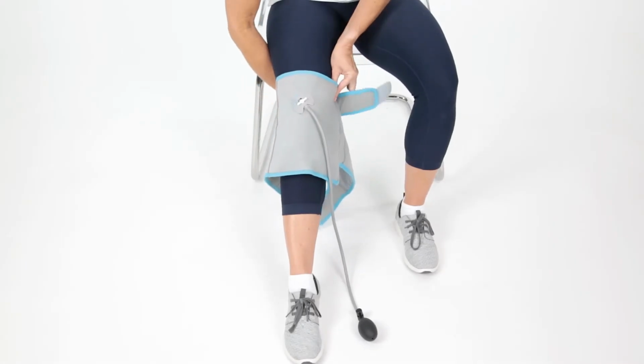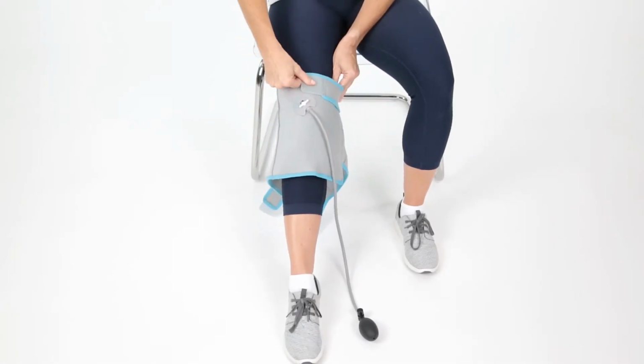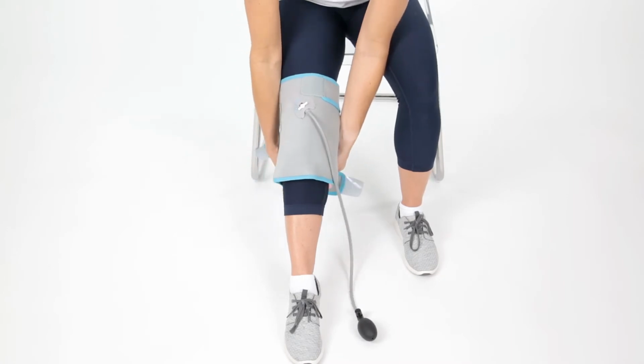Wrap and attach the top strap first, then the bottom strap, followed by 2 straps around the back of your knee.